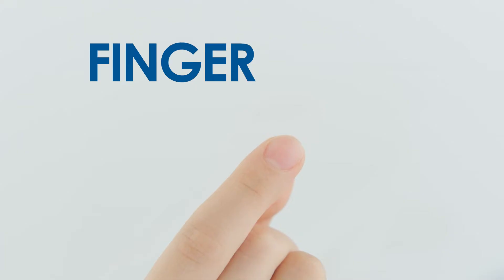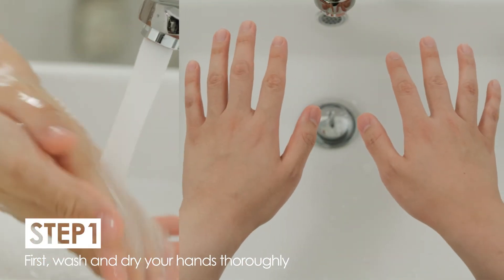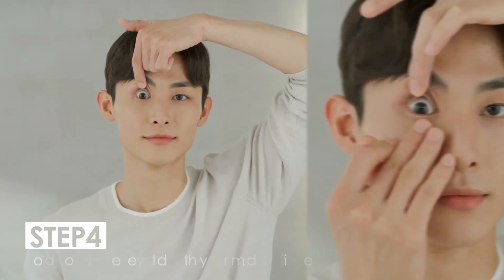Is it really hard to remove the lens? Just remember the finger heart. Wash and dry your hands, then keep in mind the finger heart hold. Hold your upper eyelid and eyelash.